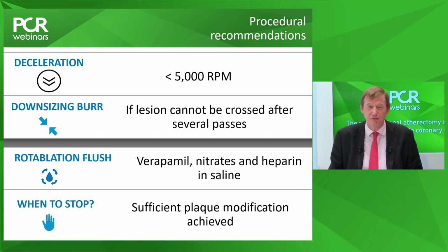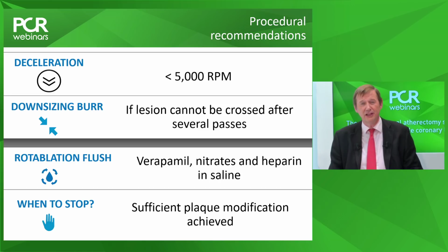The rotablation flush, we agreed there is some dispute about what's standard, but for the time being, the consensus document at least will advise verapamil, nitrates and heparin.